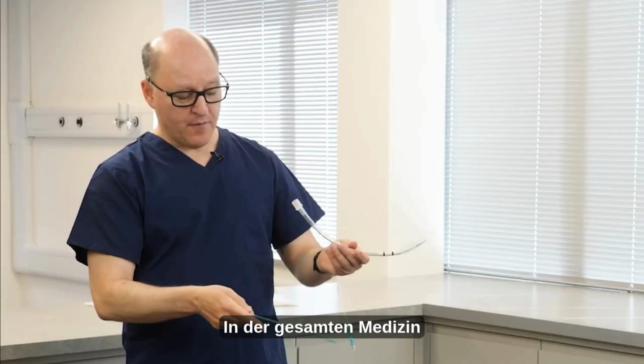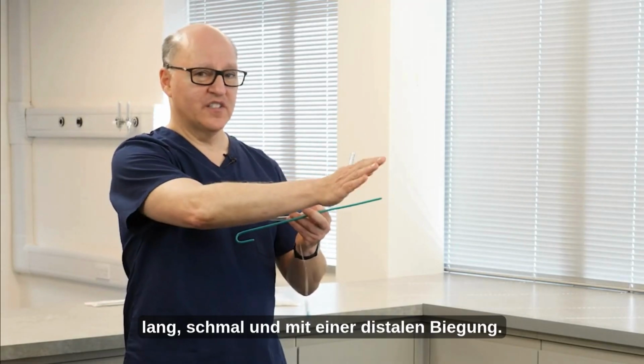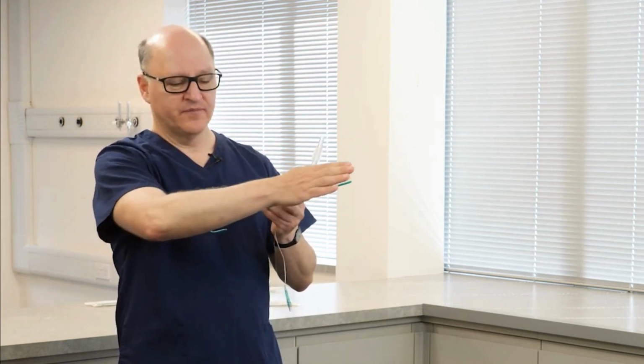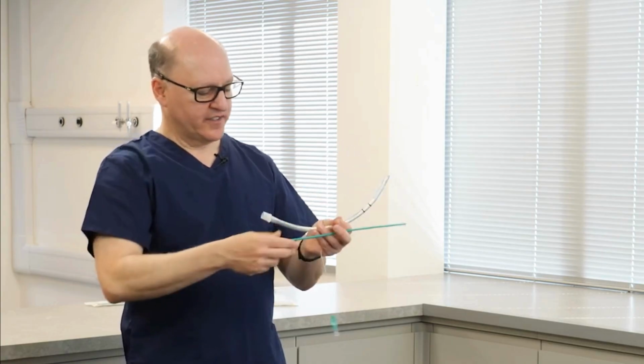And throughout medicine, there are different devices that are long and straight with distal deflections. So everything we use in narrowing body cavities has that general principle: long, narrow, with a distal deflection for visualization.